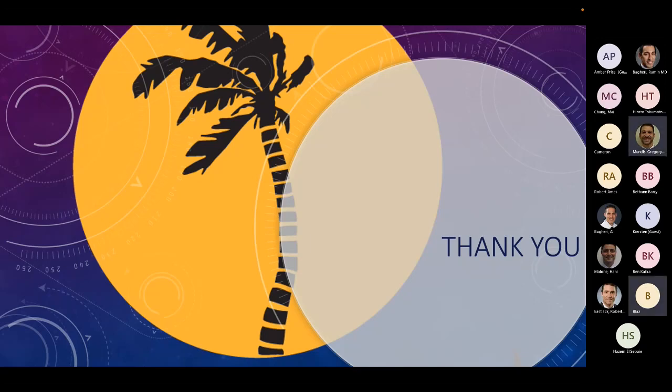Greg, I don't know, but how many of those are traction neuropraxic? It takes time. That's what I'm saying, so the monitoring's not the savior here. It's probably traction, or these are patients that have that bony hook off the inferior endplate of the L5, cephalad. I think those are the things that deserve to be identified, especially when it comes to indirect decompression at 4-5 and 5-1, which is a totally different ballgame.